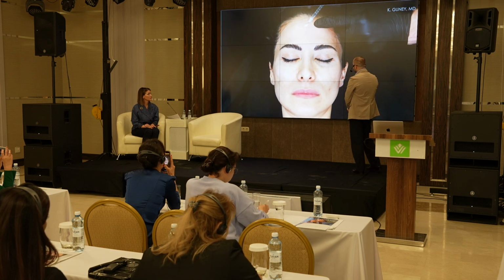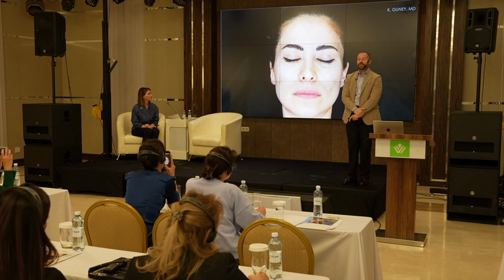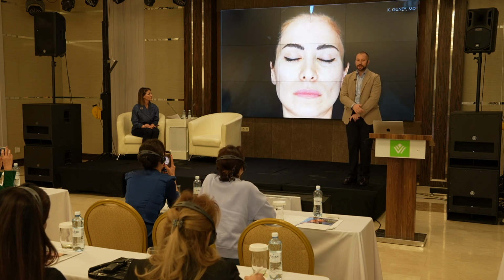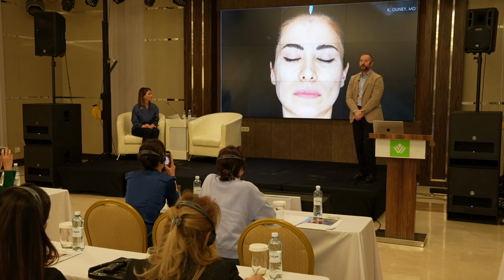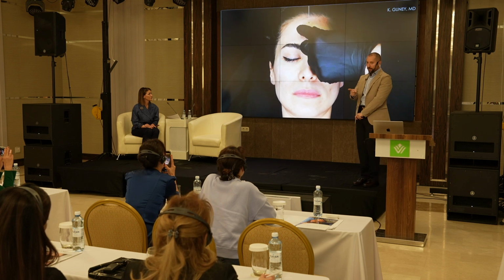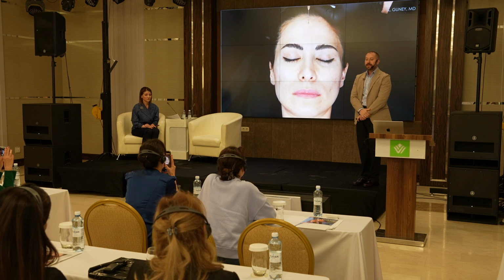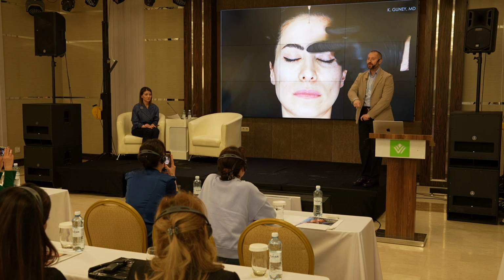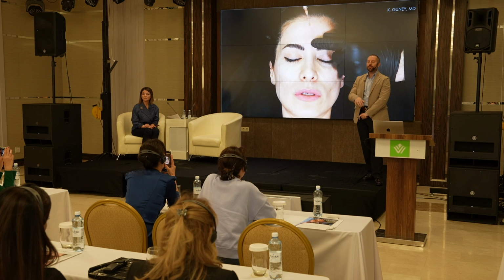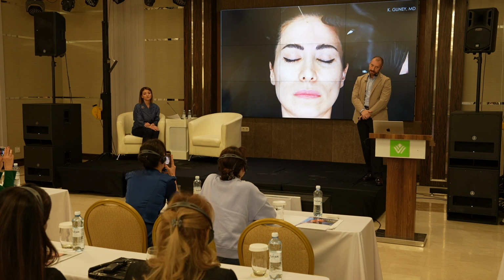And so this is the lidocaine injection entry point. You don't have to do it, but sometimes you can. It's a little bit painful. Also with the cannula, it's a little bit painful area to open your way. I measure my area to see whether the length of the cannula is good or not. Then I go to the deep tissues with the guide needle to open my way, and then go deep into the tissues with the cannula. You can work with a retrograde technique.